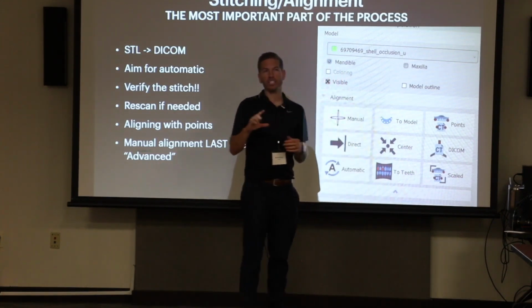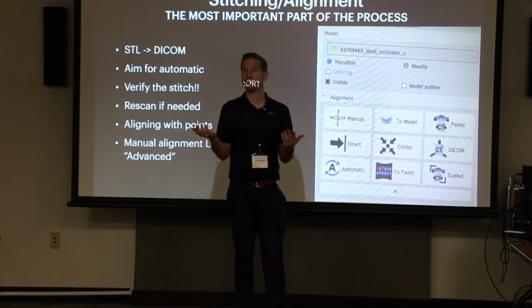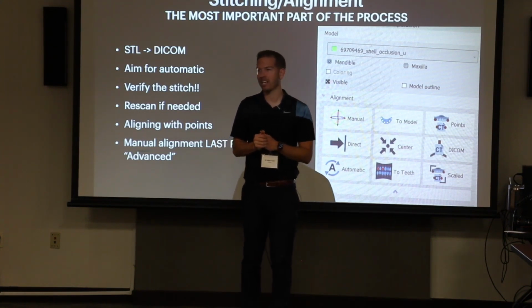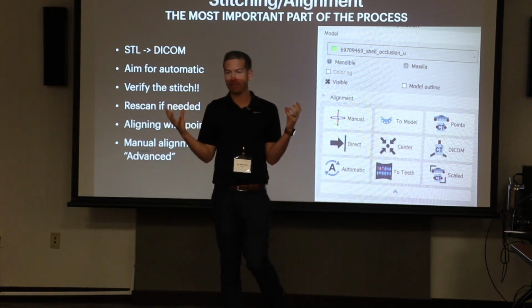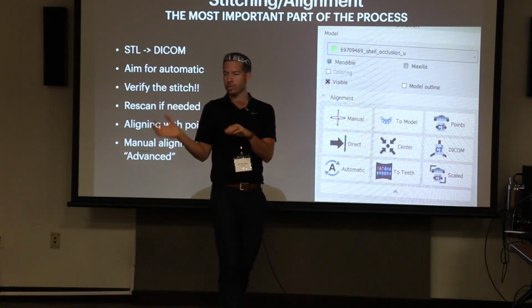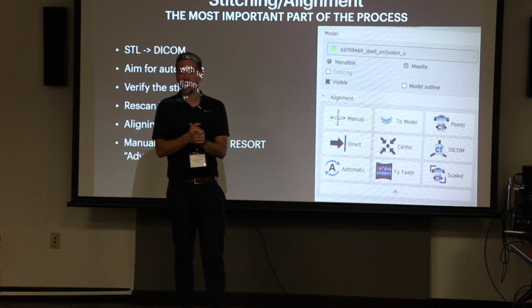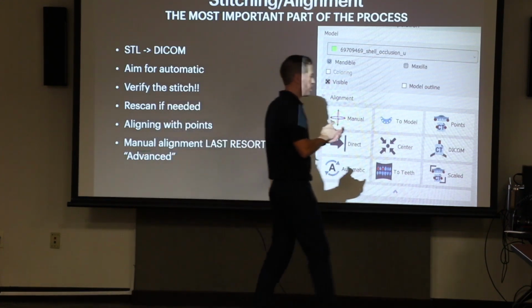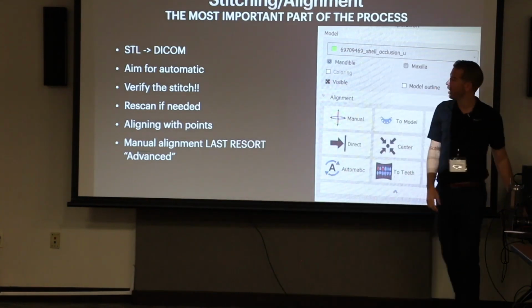And what are the 10% of the times when it doesn't? It's the scatter cases. So that's what we talked about before. The patient has 28 zirconia crowns in there, and they're scatter shooting off the CBCT, and we've lost all the tooth references. When we drop them into Blue Sky, they're going to give you an incorrect alignment potentially. So 90% of the time, it's auto-aligned.